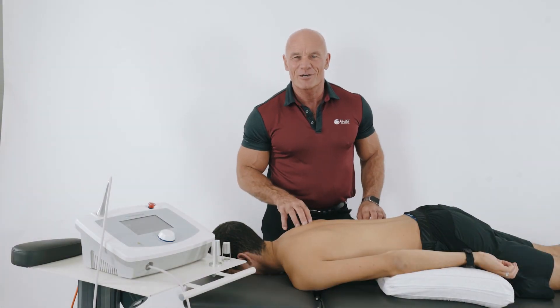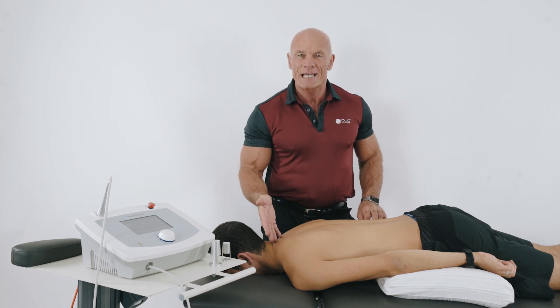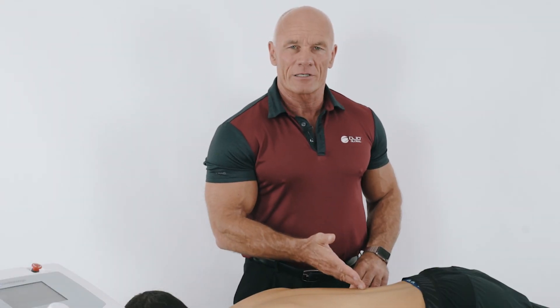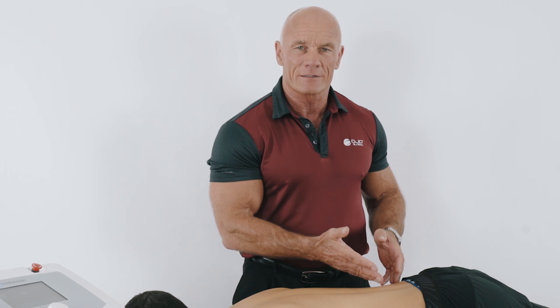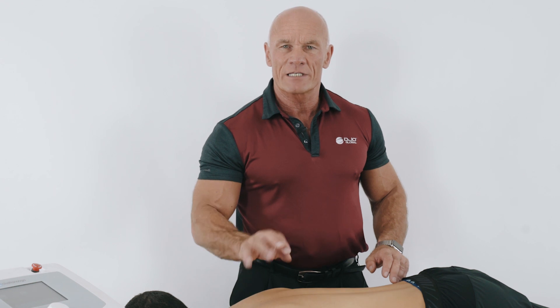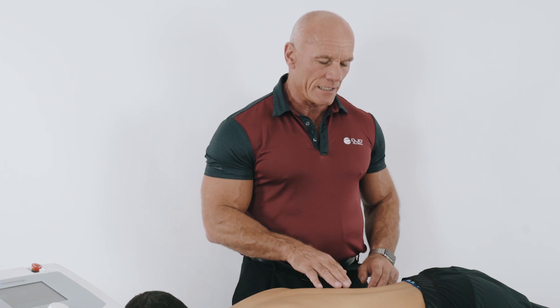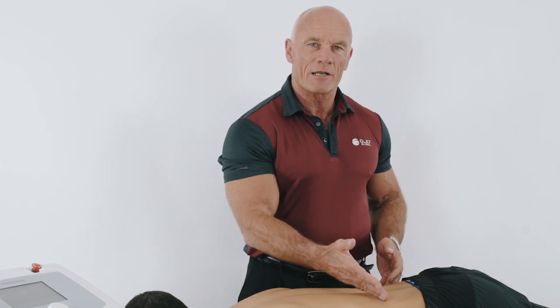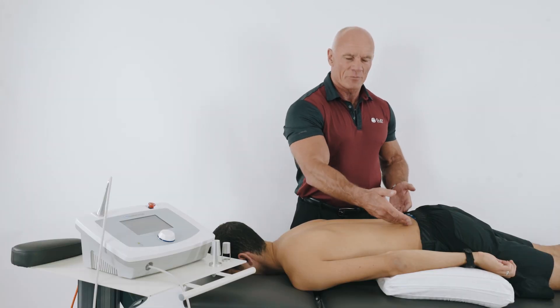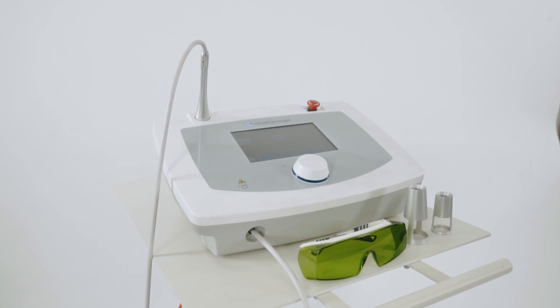Hi. In a previous video we looked at using high-power laser to treat neck pain with an associated radiculopathy. So if you have a patient presenting with low back pain with a radiculopathy, I refer you to watch that video and use the same techniques. But this patient is presenting with a non-specific low back pain with an insidious onset. The presentation is an ache from the centre going left and right. So we've chosen to use high-power laser.